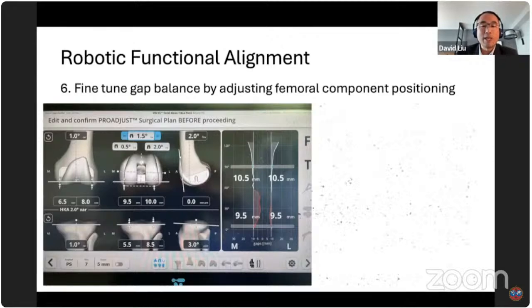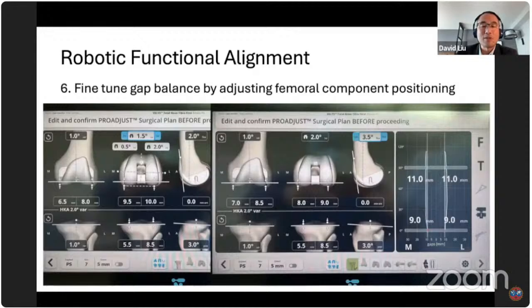This was my initial planning screen, and now this is my subsequent planning screen after the tibial cut. And you can see I have made slight alterations, only very minor ones, but the second bite of the cherry makes me feel that I'm getting a more balanced knee than perhaps I could if I did all the cuts initially. And as I say, I stress again. The problem was that what I found was the flexion gap increases more than the extension gap in a lot of the cases, and this can't be fixed alone by just an insert increase.